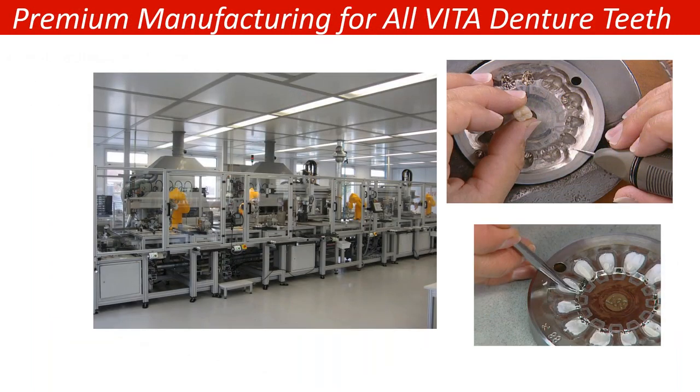So it's the same material. It's manufactured. All of our teeth are manufactured. Essentially today, they are manufactured through a process of machine. Some of the denture tooth lines are still manually layered, and they are produced in these little frames, in these little molds. So each mold is actually designed independently, if you will.